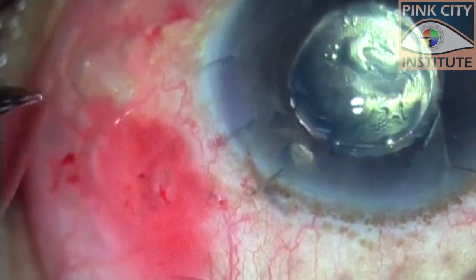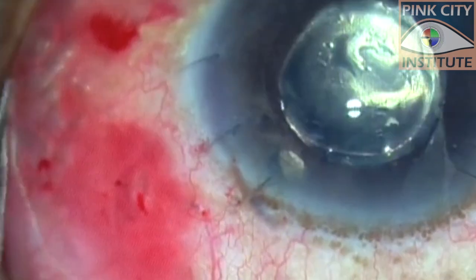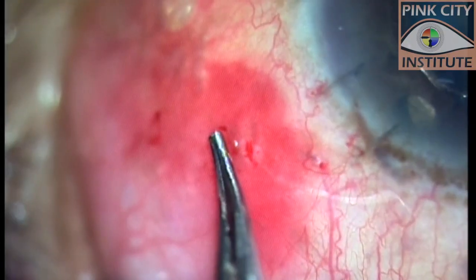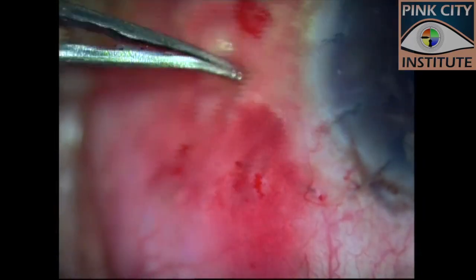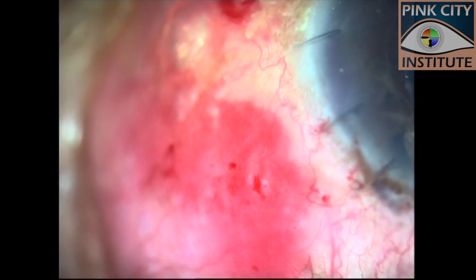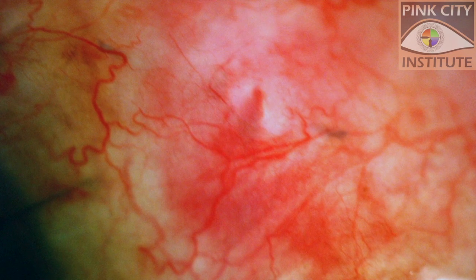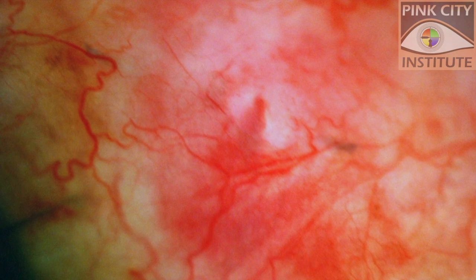After removal of the last cannula, air that had passed into the subconjunctival space was removed while watching for stability of closure of the sclerotomy. The ends of the suture and the sclerotomy can be seen here, and the wound closure is quite stable. In the postoperative period, the sclerotomy and the polyglactin suture ends can be seen in the subconjunctival space without any surface issues.